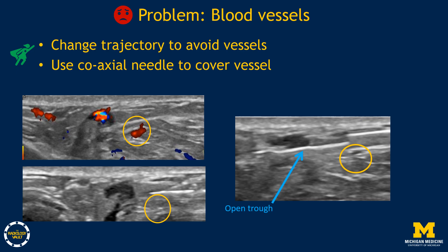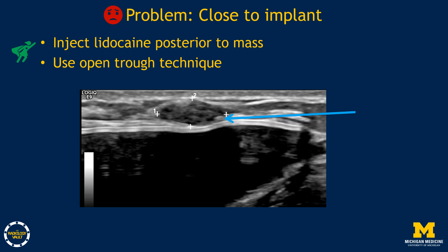Another common problem is blood vessels. The best option is to change your trajectory to avoid them altogether — this reinforces the importance of planning, which must include color flow imaging. Another tip is to use a coaxial needle to cover a blood vessel so you don't inadvertently biopsy it. After deploying the trough, check for vessels with color flow, then guide the coaxial needle over the trough to cover the vessel before firing.